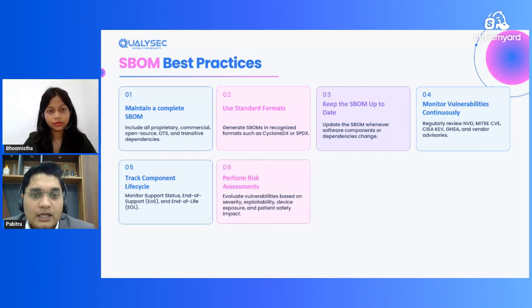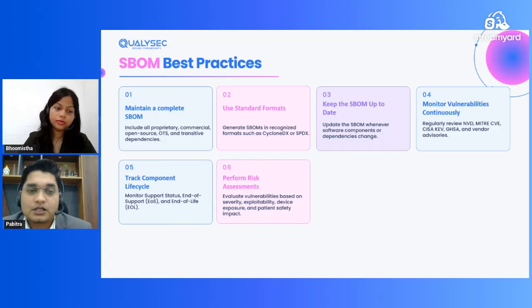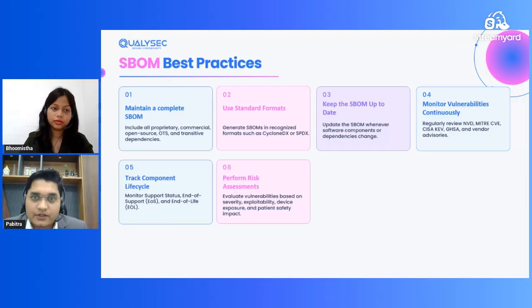Then moving forward, perform risk assessment. Performing penetration testing, vulnerability analysis, or vulnerability assessment is very important, so do it as part of best practices. See, SBOM, threat modeling, and pen testing are very correlated things. It's proof that you are handling your data securely.